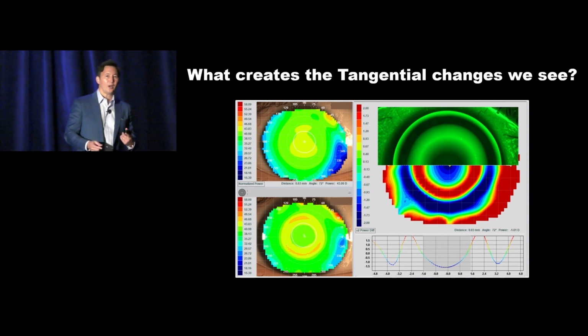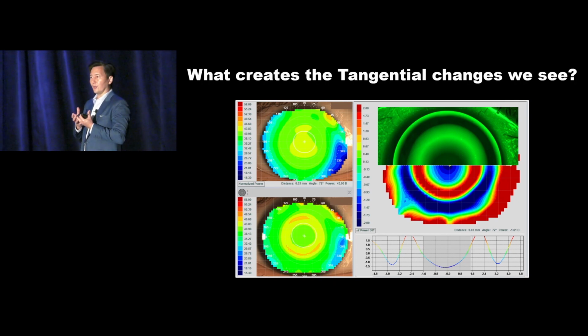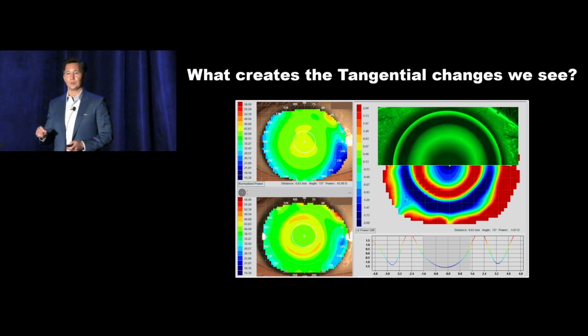So it's completely opposite to what we talked about in the center, where the central area where the lens is close to the eye is producing compressive force. Where you see the red, it's producing suction force, pull force. Now, the red ring is describing the reservoir. The next one out, the blue, is describing the alignment zone. So you can use the red and blue rings to tell you exactly where the lens was positioned when the patient was sleeping. And they become absolutely obvious.